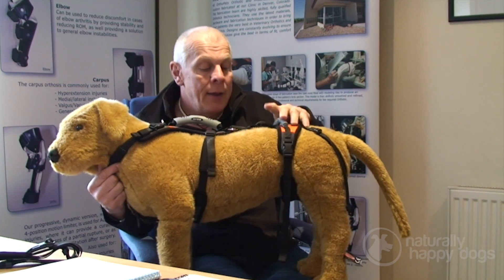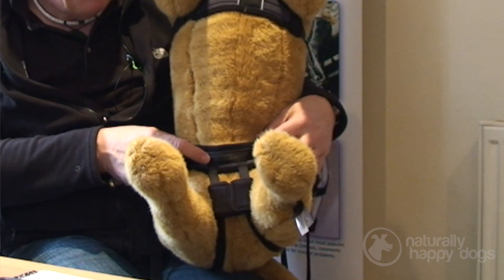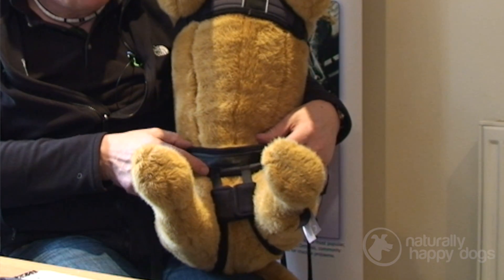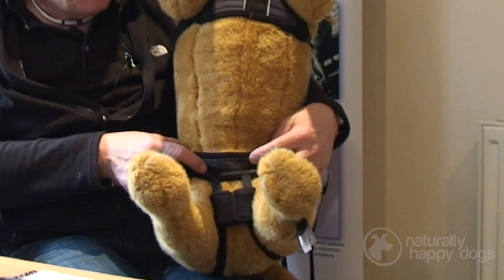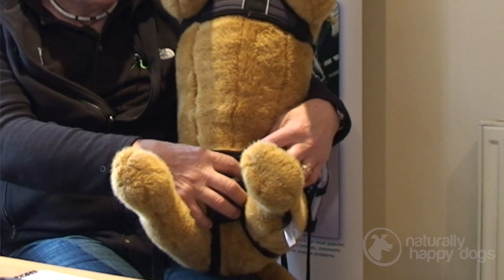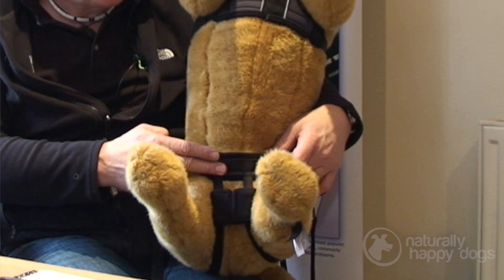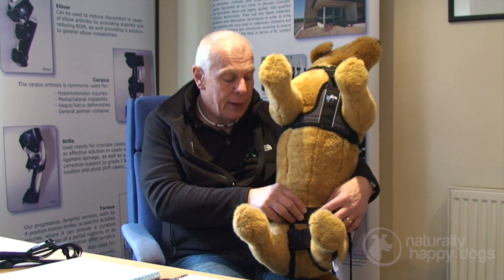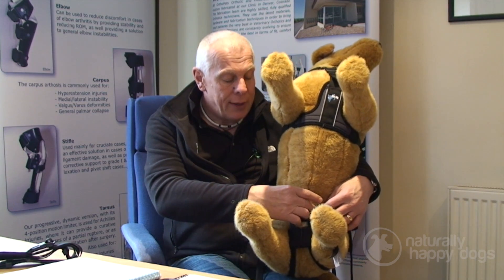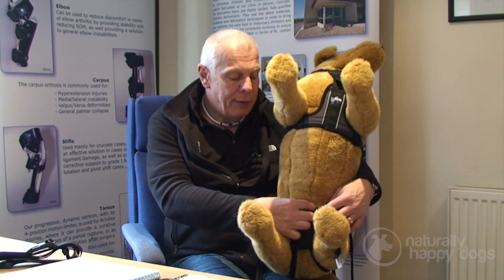There are two versions available. We have the conventional version here, which is suitable for all bitches and probably about 85 to 95 percent of male dogs. We also do another version called the U-band, for those male dogs where the penis is slightly further back — if they wore a conventional harness, the strap would go across the tip of the penis, so when the dog urinates it would wee all over the band and end up uncomfortable and smelly. The U-band, as the name suggests, has a U-shaped band that moves back, allowing the penis to protrude out the front so the dog can urinate without soiling the band.